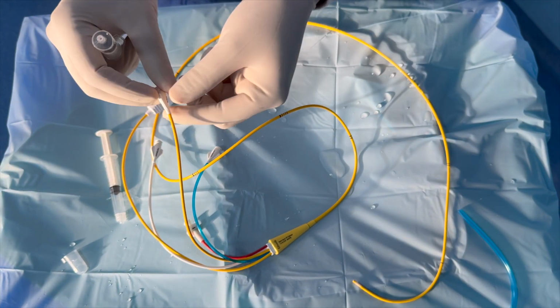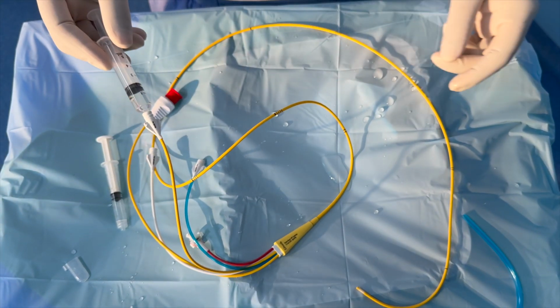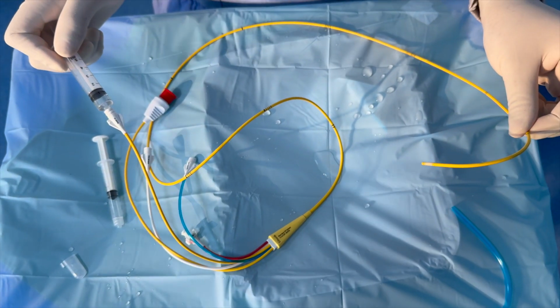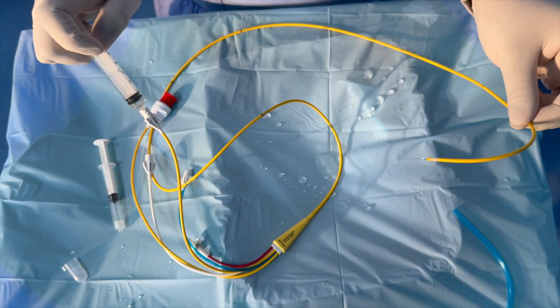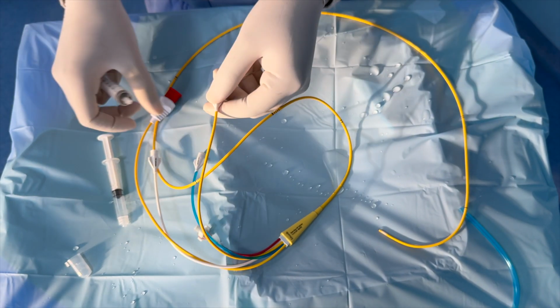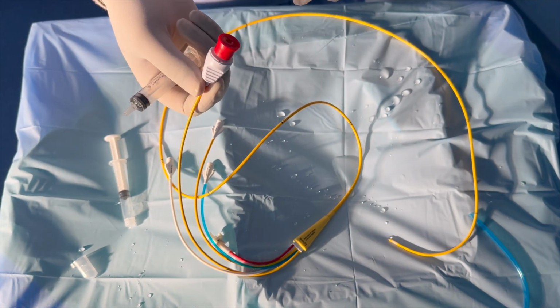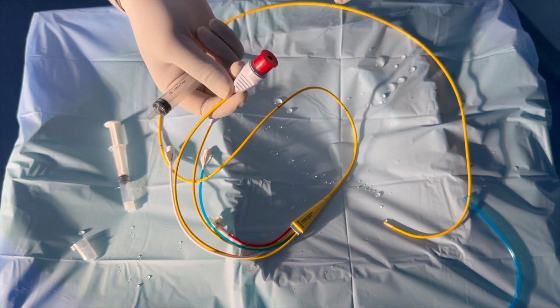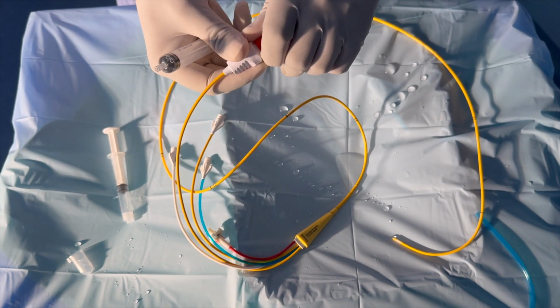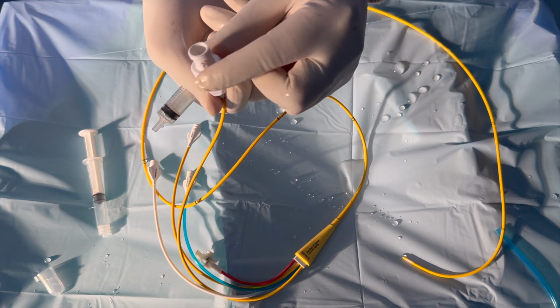And the next port is a yellow color port. Its opening is at the tip of the catheter, and it is used for PA pressure measurement. And last, here you can see the red color capped port. This is for the thermistor, and it has a few pins inside the cap. So here you can see.